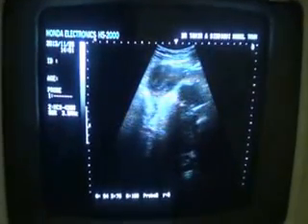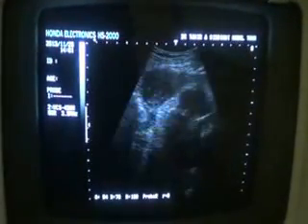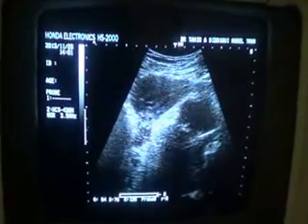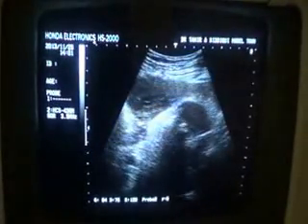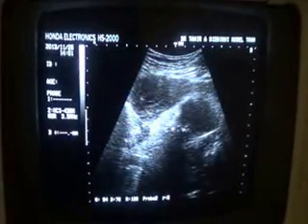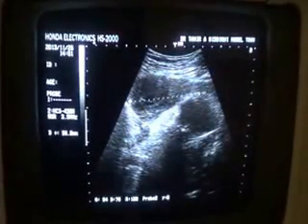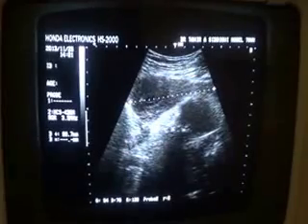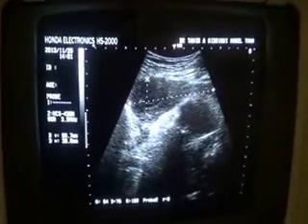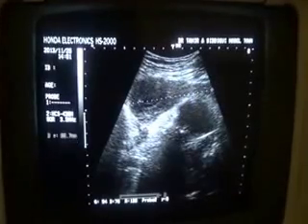This is an ultrasound study of a 24-year-old para female, where you are seeing the uterus in longitudinal section with a central clear endometrial canal, the uterus measuring 9.0 by 3.9 centimeters.